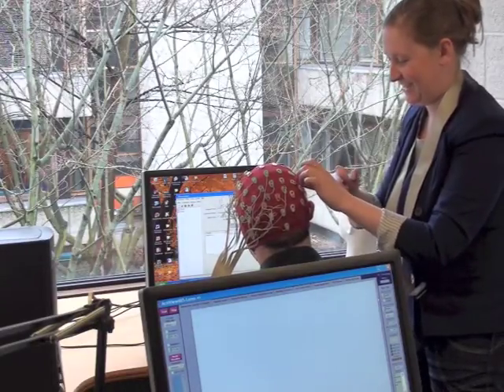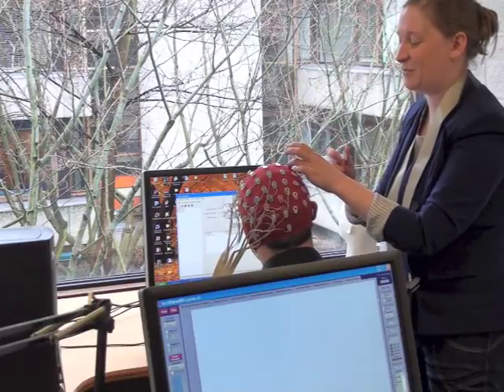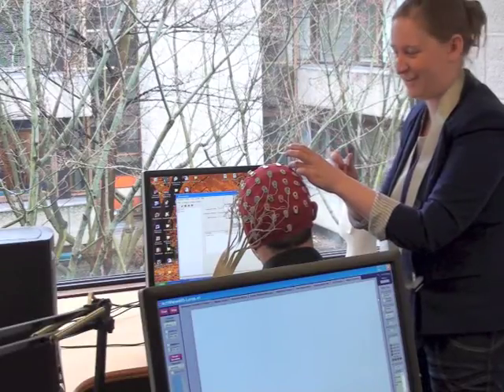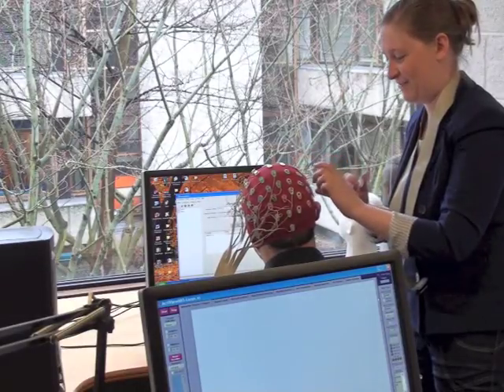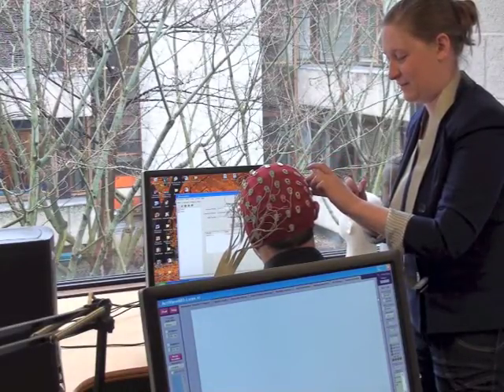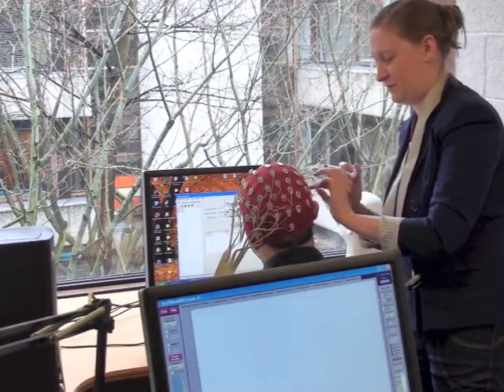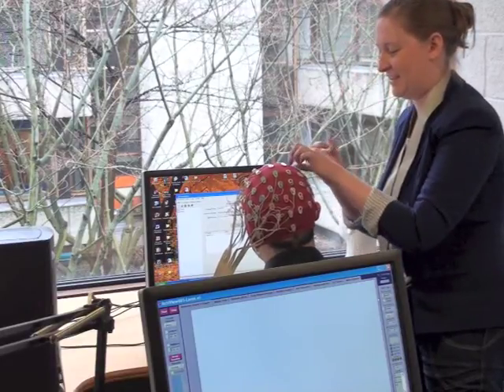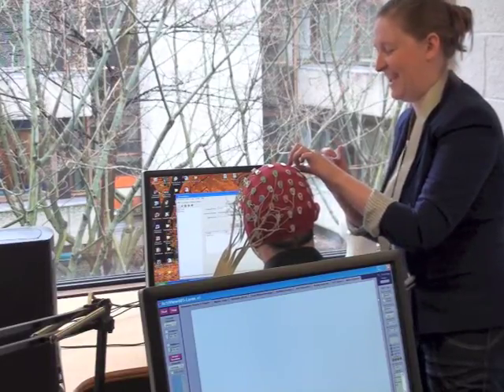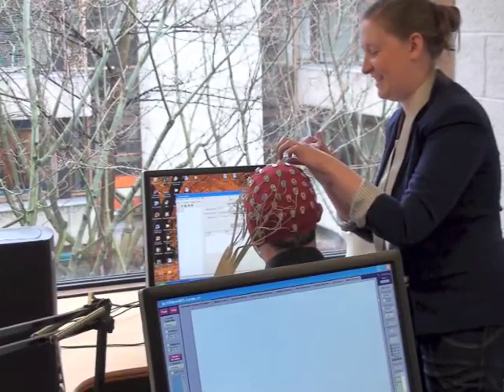Yeah. Don't say, this is the nitric acid. Or when you start analysing their brainwaves, don't go weird. Yeah, that's true. Even if some people do look incredibly weird, their brainwaves. That won't be happening today. No, yours are beautiful brainwaves. Your brain responds perfectly to all my stimuli. You're just saying that to be calm and soothing. I love it. Yeah.